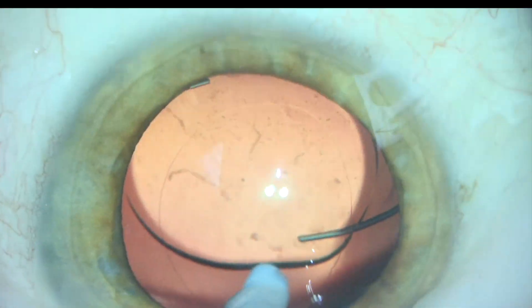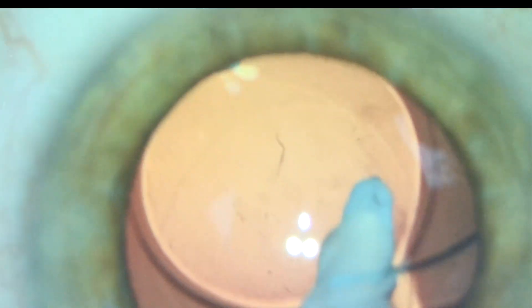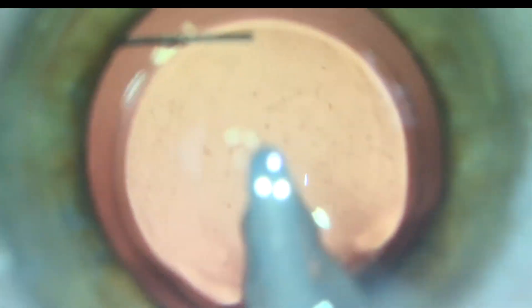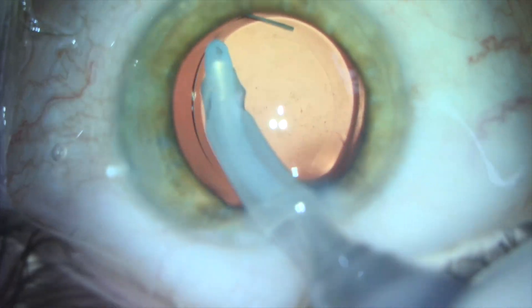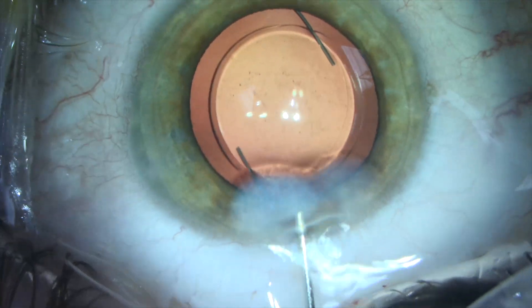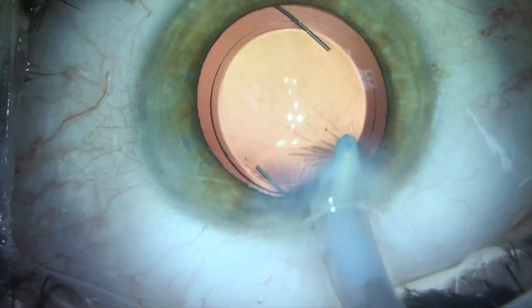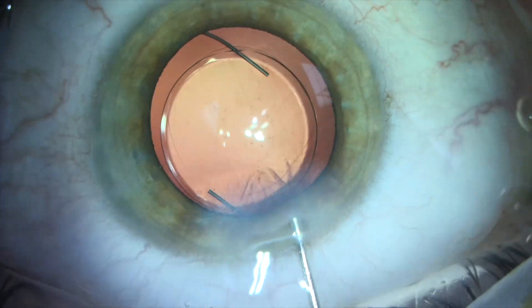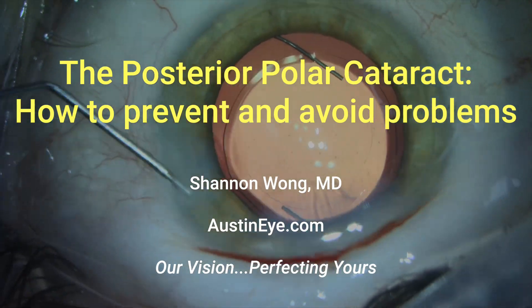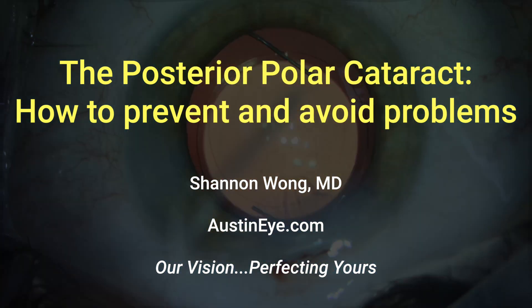The enemy of good is perfection. At the end of the case, we have a beautifully placed monofocal lens implant — the Bausch & Lomb LI 61 AO — inside the capsular bag with an intact capsule. This patient did well and had a safe and uncomplicated surgery to remove the posterior polar cataract. I hope this video was helpful. Have a wonderful day.